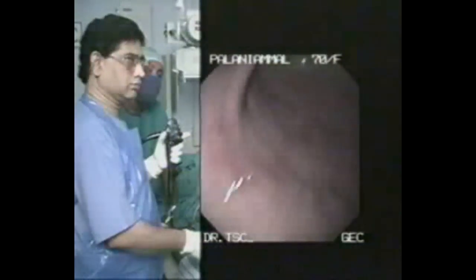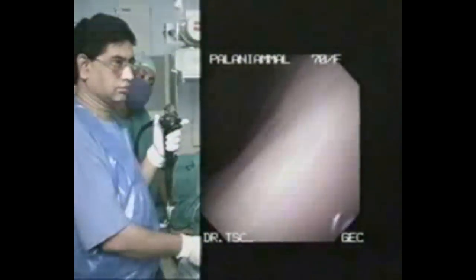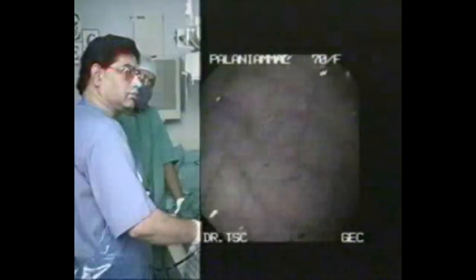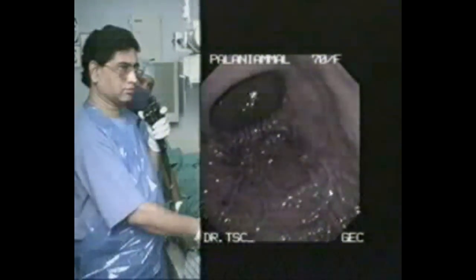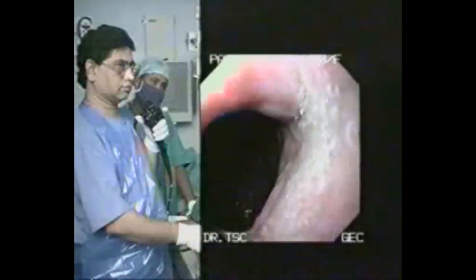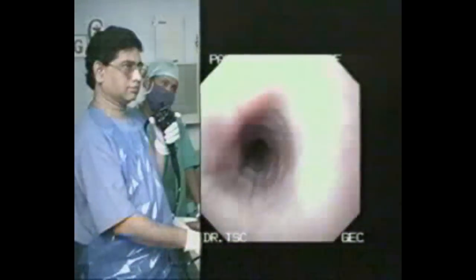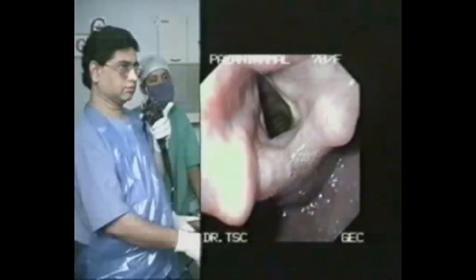On your left will be the anterior wall of the stomach, and on your right will be the posterior wall of the stomach. Up will be the lesser curvature and down will be the greater curvature. Pliability of the mucosal folds can be appreciated on deflating the stomach. Do not forget to suck the air while you are withdrawing the endoscope.